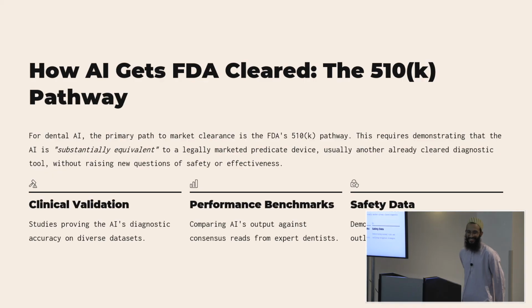During the evaluation of the model, you mentioned you evaluate based on the test data set, right? And then you get how well the model is performing on that particular data set. Sure. So when it's actually in production, and the model is now classifying the radiographs, how do you evaluate during production itself? Do you have the actual dentist also comparing against the model performance to know how well the model is actually doing at that point of time?